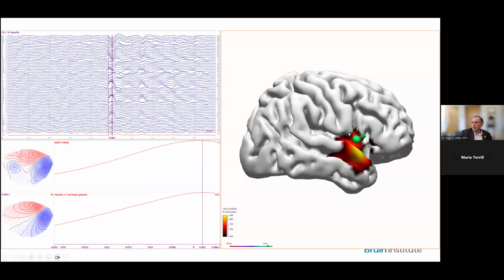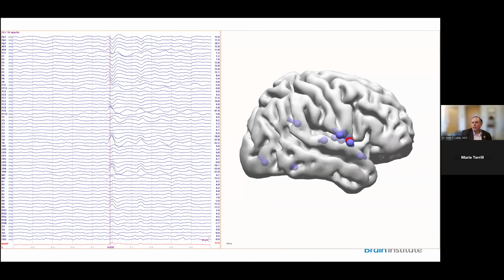Our confidence ellipsoid has dropped because our signal to noise ratio is higher, but we have a different orientation and a slightly different location. Not very different in location, but by orienting, we're talking about a potentially different cortical location. So now let's talk about what we did if we modeled each spike at the half rising point, and I included in it the average across those spikes. And again, we have those significantly dispersed. This is not a very tight appearance.